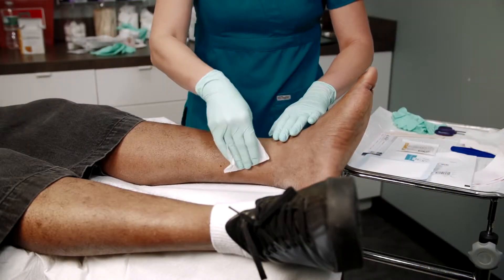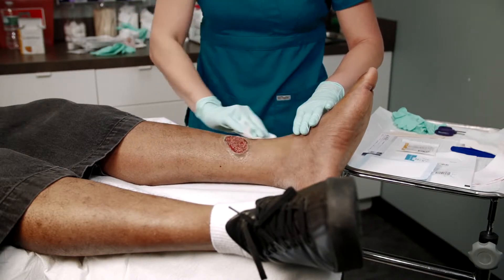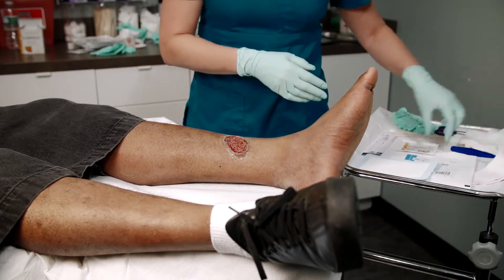After properly cleaning and preparing the wound by applying a protective skin barrier to the peri-wound, we are ready to apply MetaHoney Calcium Alginate to this venous leg ulcer.